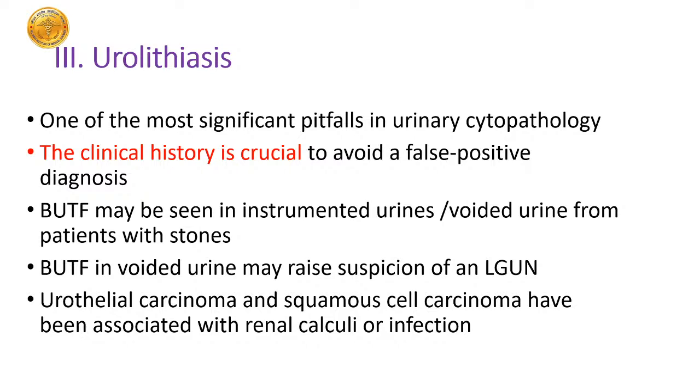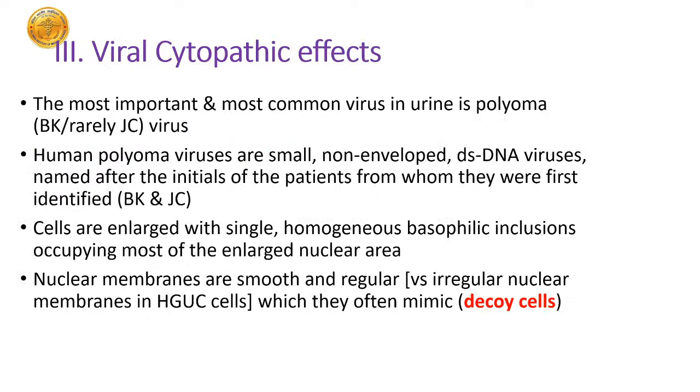Right. So again, I'm reiterating, urolithiasis is one of the most significant pitfalls in urinary cytopathology. And the clinical history is crucial, which we often do not get. And these cells can look quite ugly, leading to an overdiagnosis of atypia or suspicious. We all know that urothelial carcinoma and squamous cell carcinoma have been associated with both renal calculi or infection. Next slide, please.